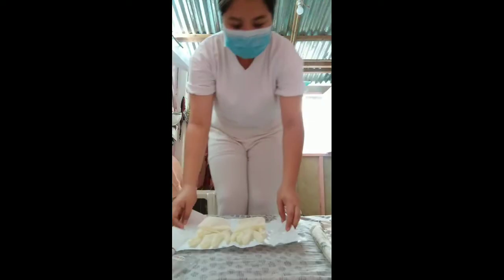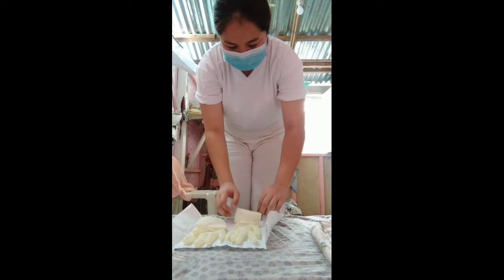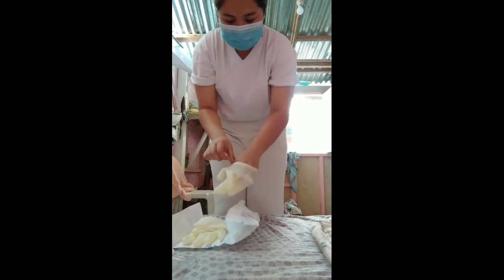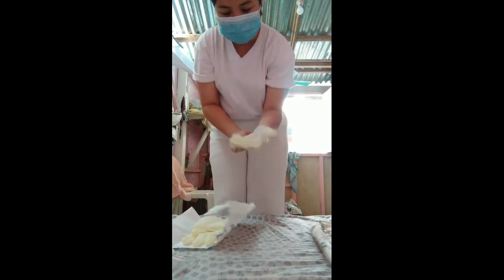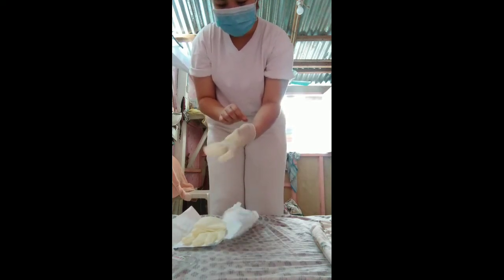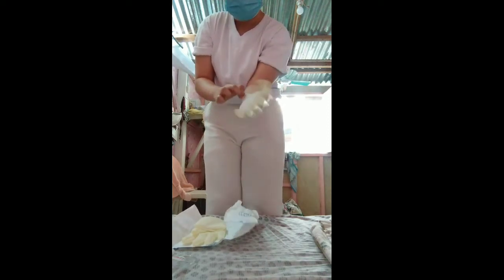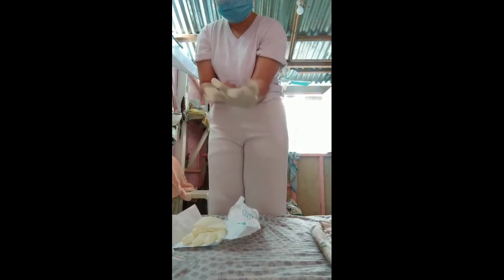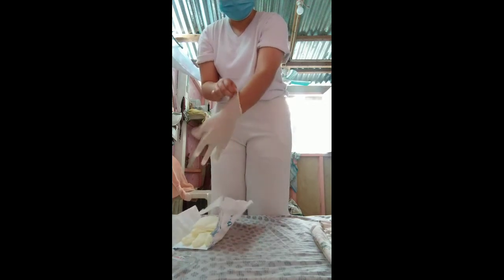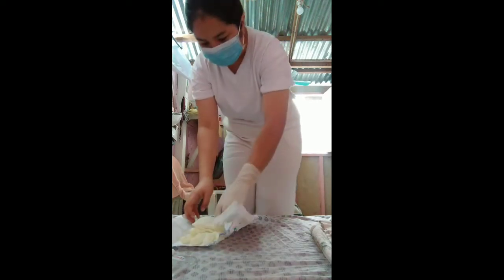So let's put on the sterile gloves. For putting on sterile gloves, we must be very careful so that they won't be contaminated.